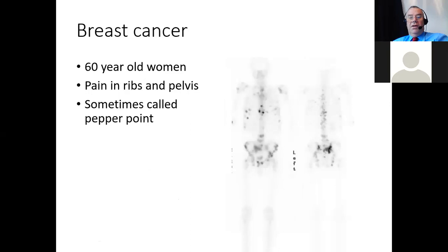So this is another typical pattern with breast cancer. So I don't know if any of you like going to fancy Italian type restaurants. There's that one in Pretoria we went to a couple of years back where we had pizzas. But if you sit down for a meal, after you've had your pasta or whatever, they bring along this very, very posh pepper grinder, a very big wooden pepper grinder, and they grind the black pepper and it sort of scatters all over your food.